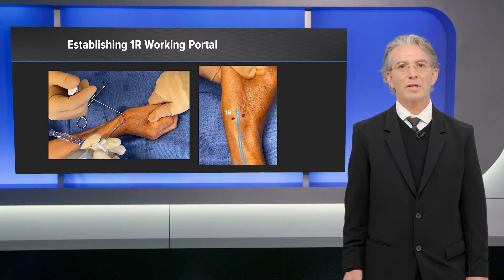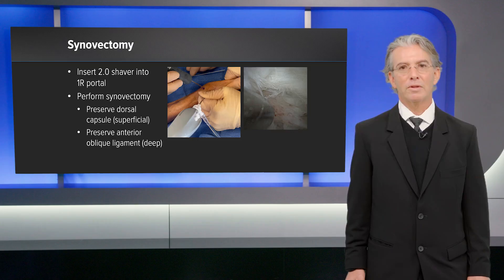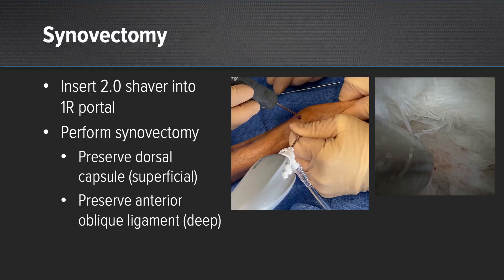Establishing the 1R portal: again, with gentle traction, use a blunt trochar to enter the 1R portal. This can then be visualized, and then place the shaver through the same portal.